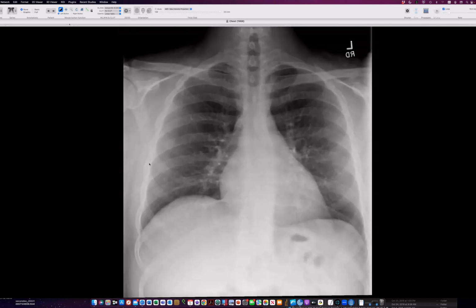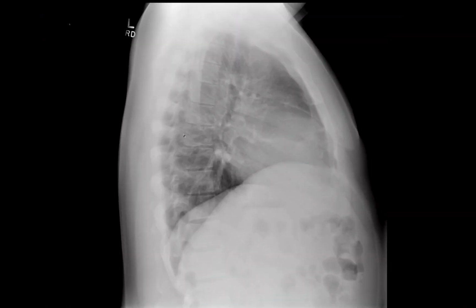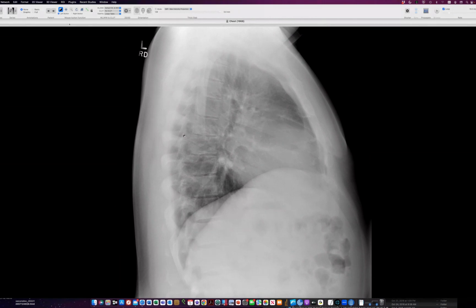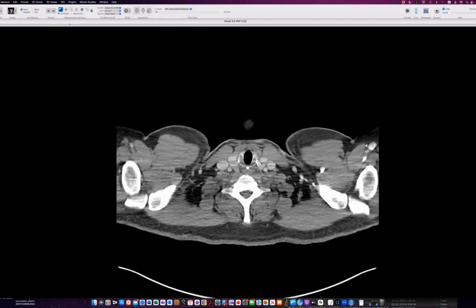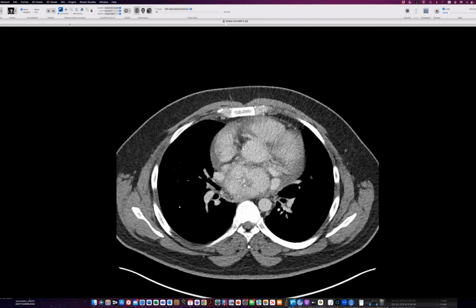Okay, this person has a pretty normal looking chest radiograph, this outside radiograph. And I'll flip this around to conventional orientation, because I find I really can't interpret them very well when they're not facing the right way. And you don't see any hint here of the mediastinal lesion, which is quite large and very vascular here.